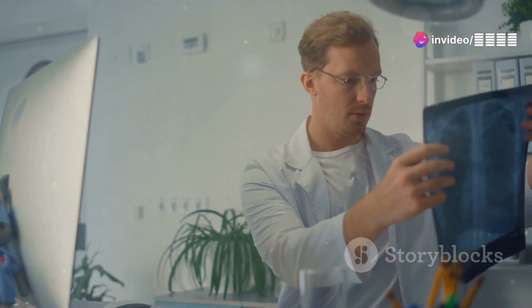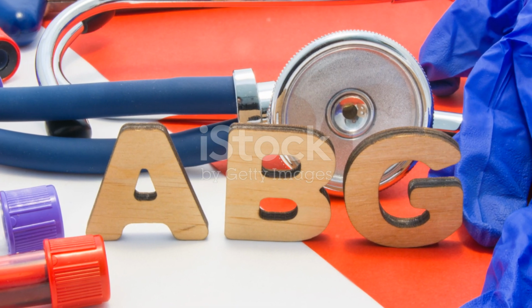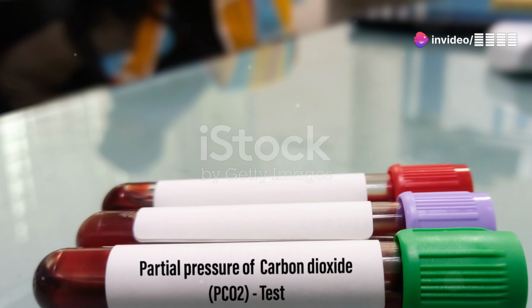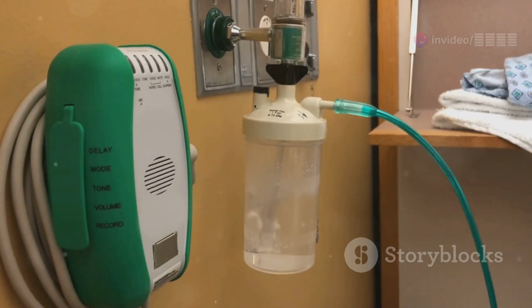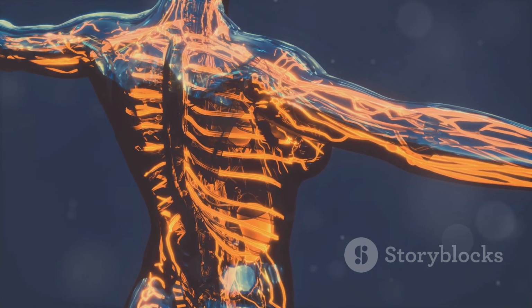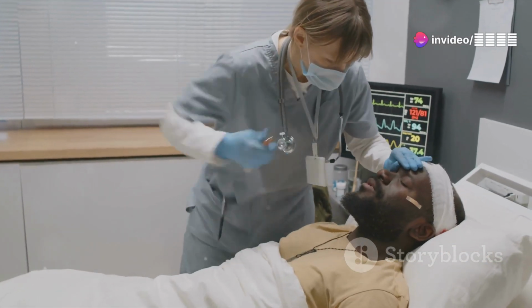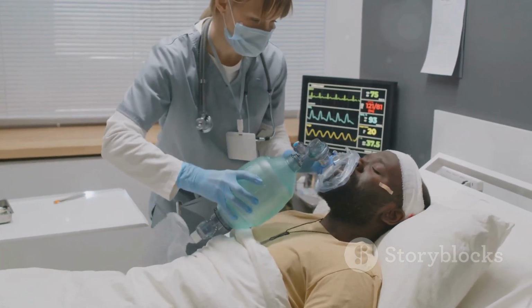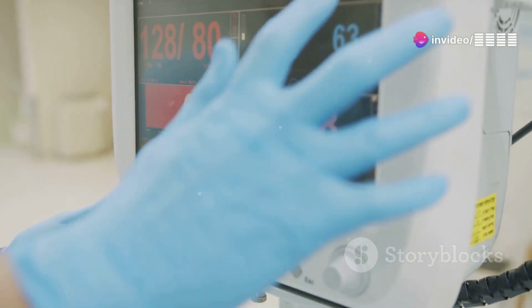Section 6. PO2 and HCO3. Oxygen and bicarbonate's role. In addition to pH and PCO2, ABG analysis also measures PO2 and HCO3, providing a comprehensive assessment of respiratory and metabolic status. PO2, or partial pressure of oxygen, reflects the amount of oxygen dissolved in the blood. Think of PO2 as a measure of how effectively oxygen is being delivered to the body's tissues. Oxygen is essential for cell function, and low PO2 levels, known as hypoxemia, can be a sign of lung disease, heart problems, or other conditions. Normal PO2 levels typically range from 80 to 100 millimeters of mercury.